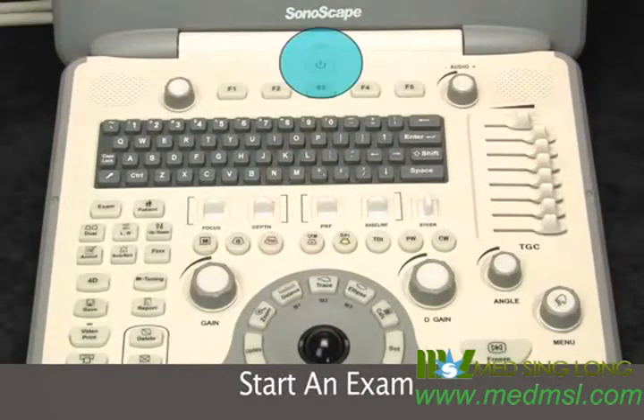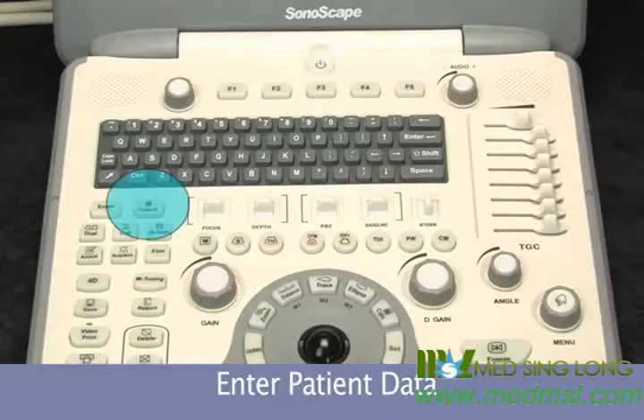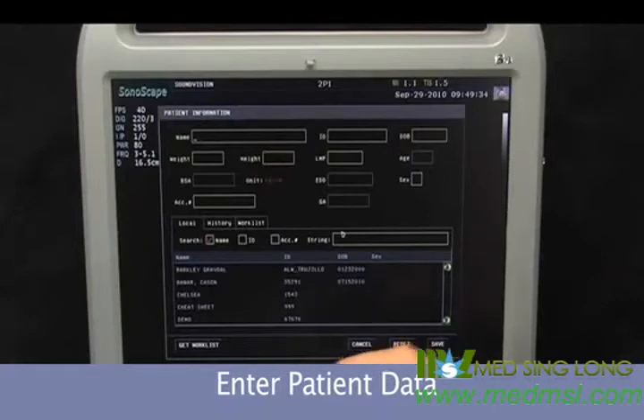So now we'll power the system on. It may take a little bit longer than what you're accustomed to with other machines because this is a very software-driven system. So now we'll just begin exam — patient — then we type in the patient name.